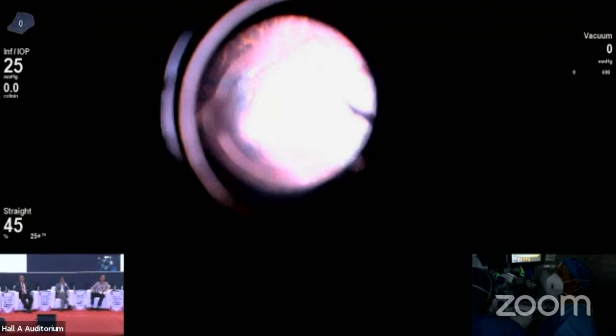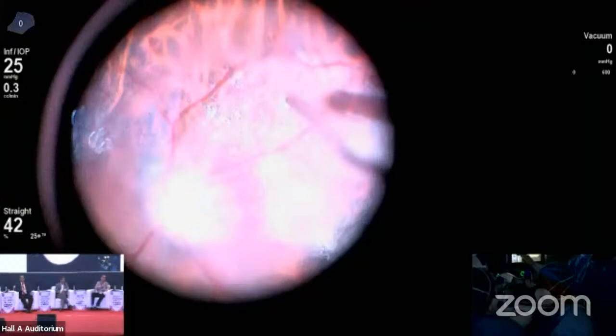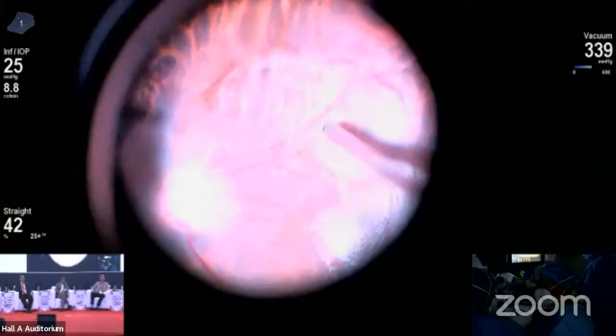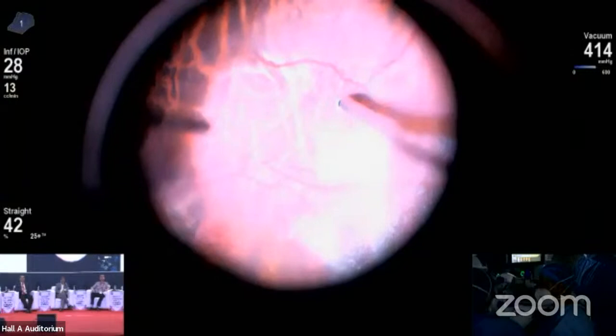So can you see the posterior pole clearly, sir? If possible, can you reduce the illumination slightly? Is it better now? Illumination now. So as I'm going closer to the retinal surface, you can make out, I can aspirate the crystals. They reassure us that there's no residual vitreous on the surface of the macula.